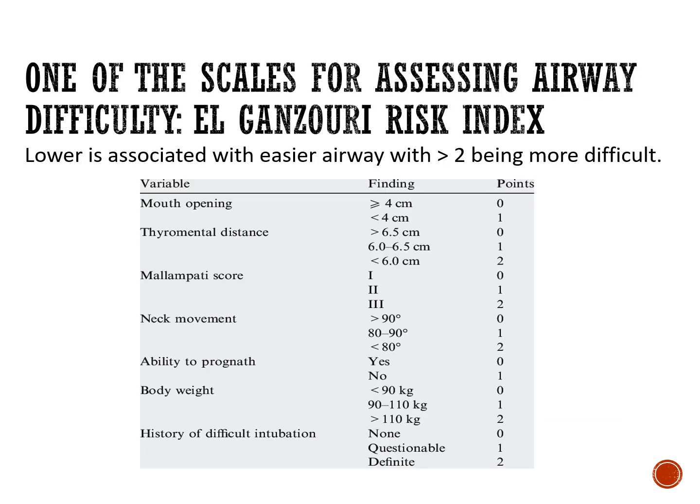So in a few portions of this presentation, we've talked about some of the individual factors that are more closely associated with a difficult airway. However, I also wanted to mention that there are some integrated scales that are out there that look at multiple factors simultaneously in order for the clinician, the anesthesiologist, the attending physician, the respiratory therapist, to look at these various factors in advance and try to assess the degree of difficulty that they may encounter in intubating the patient.